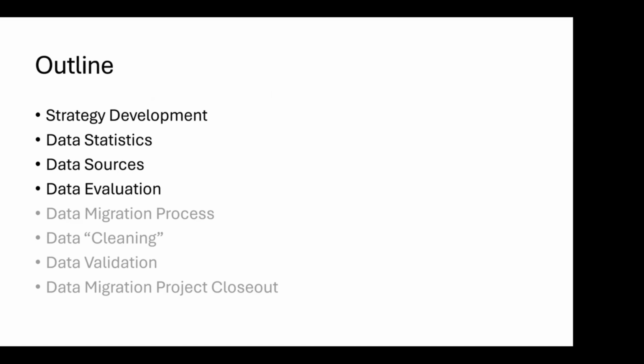When organizations are doing a data migration, we're primarily going to be talking about medical imaging migration, but we'll also touch on things like reports and conversion of data from proprietary to standards. What I often tell people who are about to embark on this is that you need to expect that some of the data that you've been storing may not be able to be migrated. Either there's a problem with the structure of the data, it's corrupt, or it was never valid in the first place. If you take the time to look at the data, you're also going to find a lot of things you didn't expect: missing attributes, incorrect attributes, patients that didn't merge, those kinds of things. So we're going to talk a lot about that.